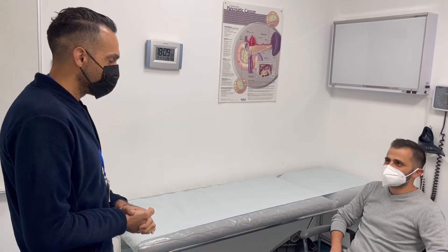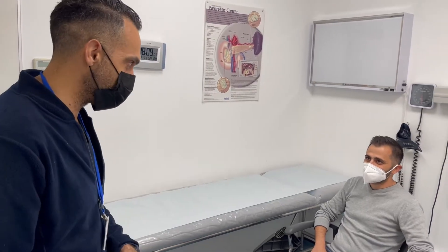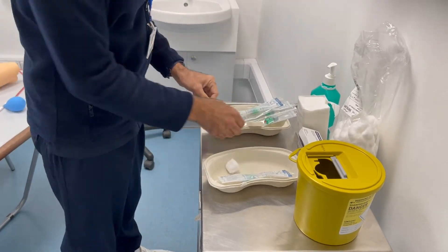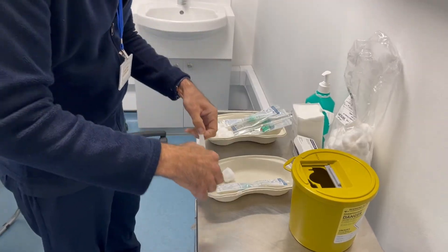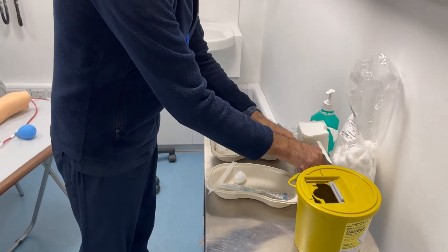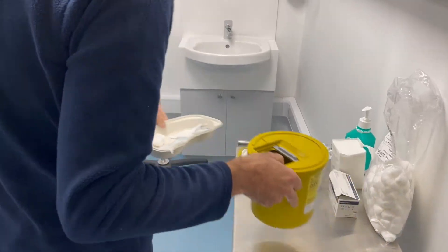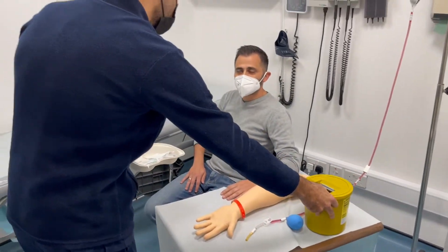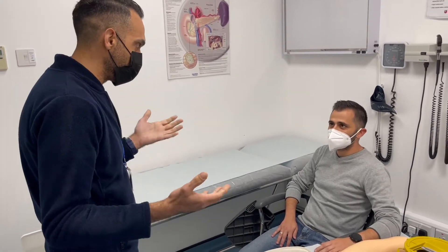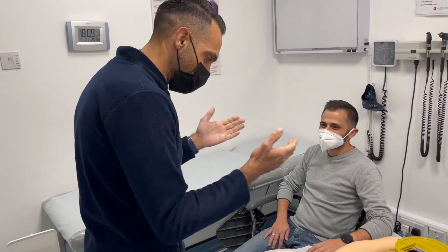Are you in any pain at the moment? No. Would you like a chaperone during this consultation? Excellent. I'll just go ahead and gather my equipment. And before we begin, I do want to ask you a couple more questions. Are you on any blood thinning medication? No. And are you allergic to latex gloves? No. And do you have a phobia of needles? No. I guess you don't particularly like them, but it's not a phobia. Okay, perfect.